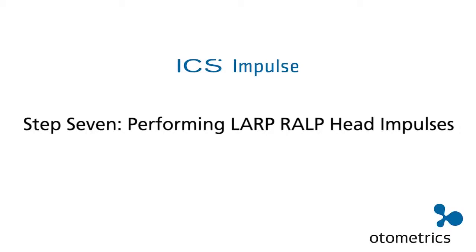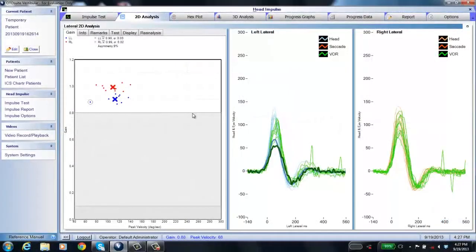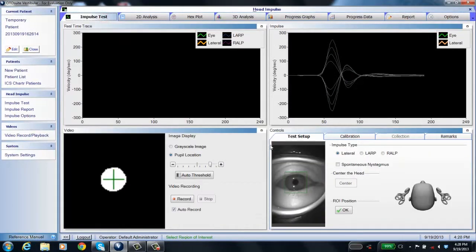We just finished doing lateral head impulse, and now we want to do the vertical canals, the anterior and posterior canals. We're going to start with LARP — that's left anterior, right posterior.